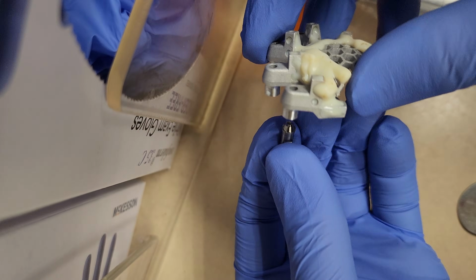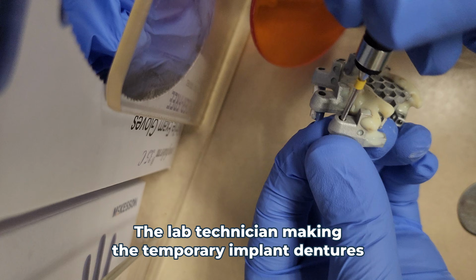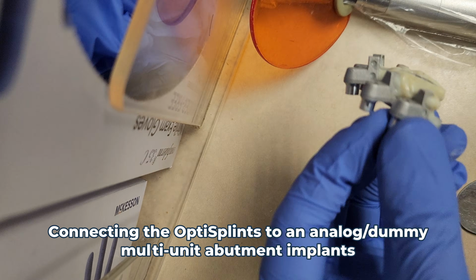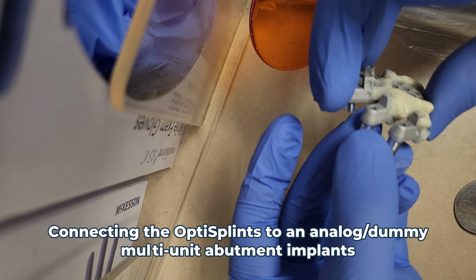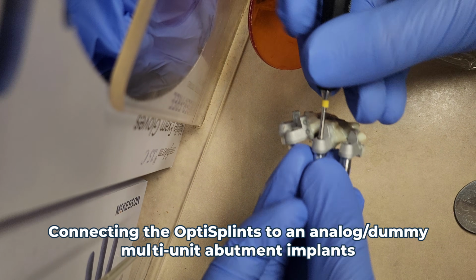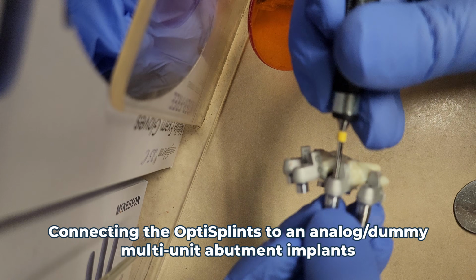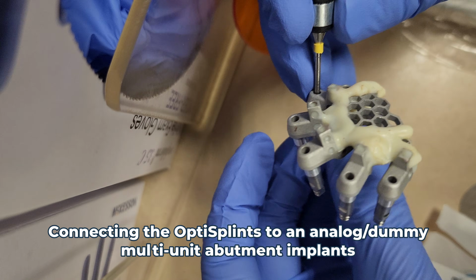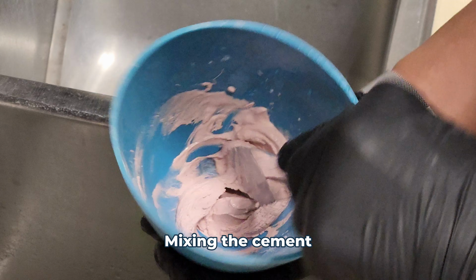Meanwhile, the lab technician starts the process of making the temporary or provisional implant denture. First, he takes that OptiSplint and he connects it to dummy or analog MU abutment implants. He then takes this cement or stone and places the OptiSplint matrix into it, as it's a fast setting stone, so it goes from liquid to hard in just 30 to 40 minutes.